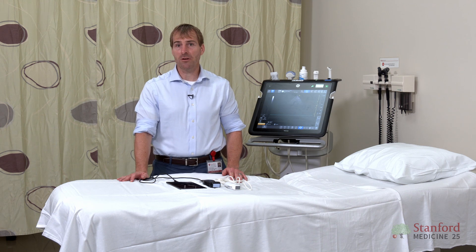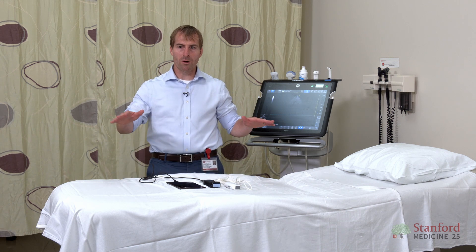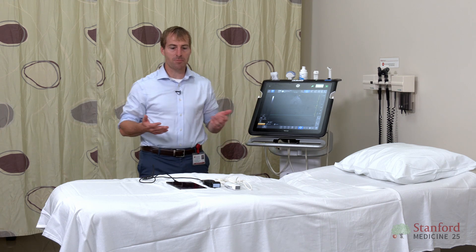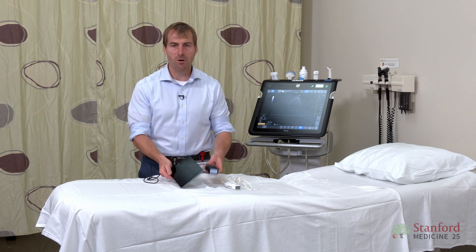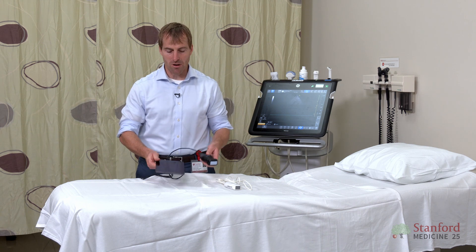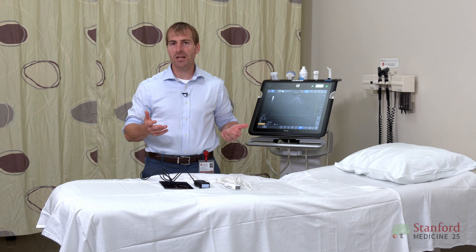Next, you really want to think about your clinical setting. If you're in a clinic or an ICU where everything's on one floor, you can push a big cart-based machine like this around — it's not too bad. But for someone like myself who's working in the hospital on many different floors, I really need something small that I can put in my pocket. I want to keep this machine on me at all times; I can just throw it in a little bag over my shoulder.